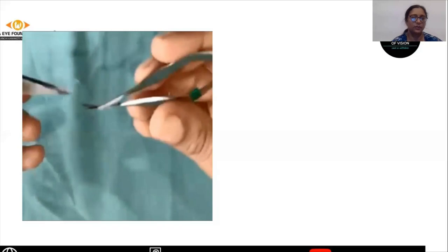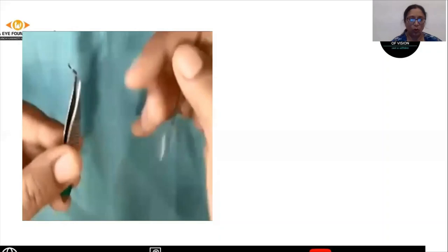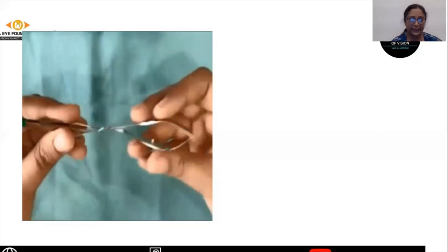The next step is doing the PI or the iridectomy, for which you need the iris forceps, which has a small bent and toothed design. It can hold the iris well under the sclerostomy ostium.